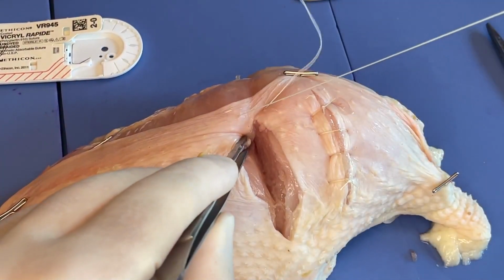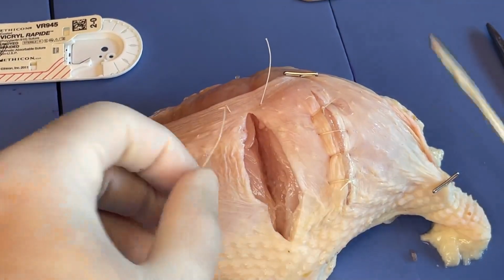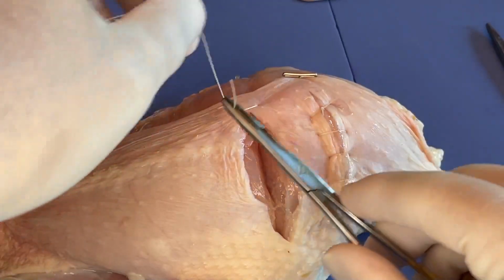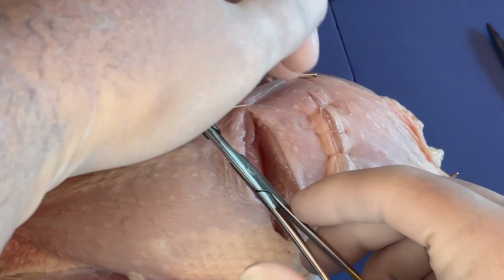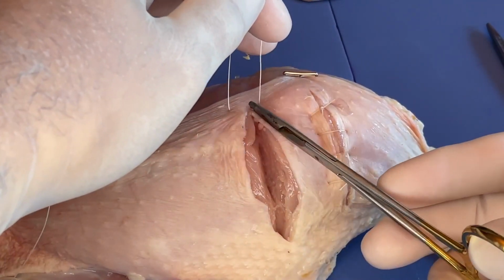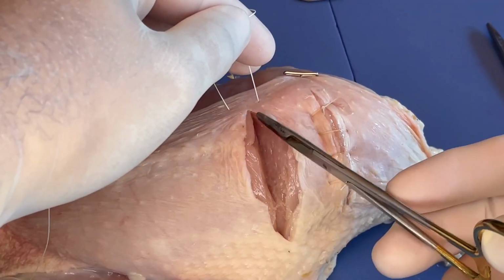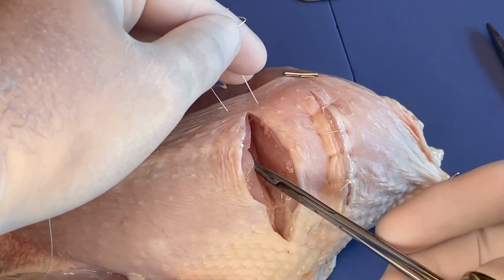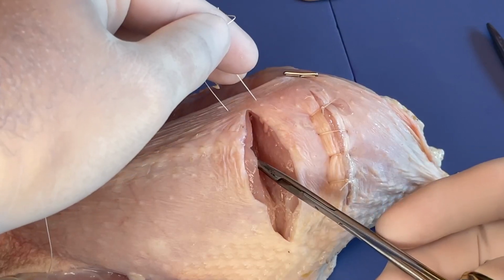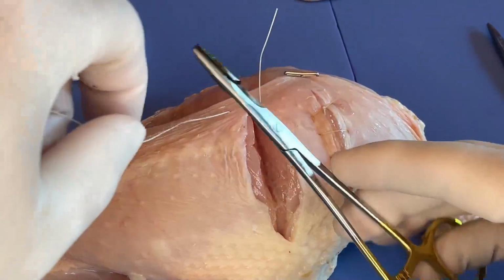So what we've done here is we come to tie this, and we're going to do an instrument tie just because we are running a little bit short on this suture. But what we've done is we've made it so that as we tie this and get tissue compression, we have the beginning of tissue compression up beyond where the tissue is actually divided. So every bit of divided tissue, possible areas of bleeding, cut or exposed blood vessels, will be within the line of our suture.